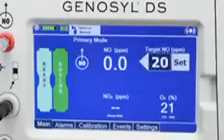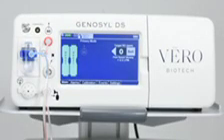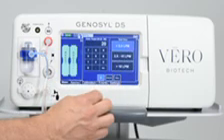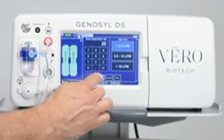If the Set button is not present on the screen, ensure there is flow through the patient's respiratory device and the adaptive sensor icon is green with an arrow. When there isn't an adaptive sensor connected, press the Set button. Select the total flow range on the user interface that matches the flow of the patient's gas delivery system, bias flow and minute ventilation. Enter the prescribed dose of nitric oxide and press OK.